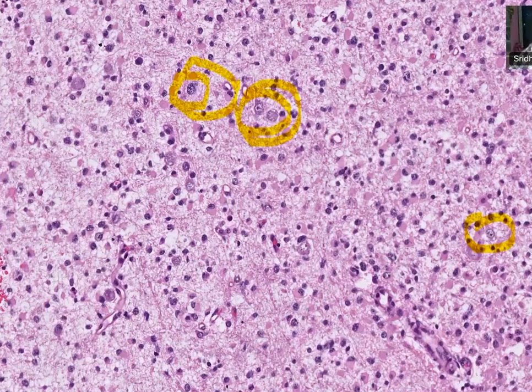Significant mitosis, grade 3. A few mitosis, it's grade 2. Mitosis, it is grade 3. There is a little bit of gray area about the number of mitosis required for an astrocytic tumor for upgrading it. There are various thought processes, but I can tell you simplistically, in a slide, if you find 2 or more mitosis, less than 2 is probably doubtful. At least 2, if you find it, it is significant to upgrade it to grade 3.